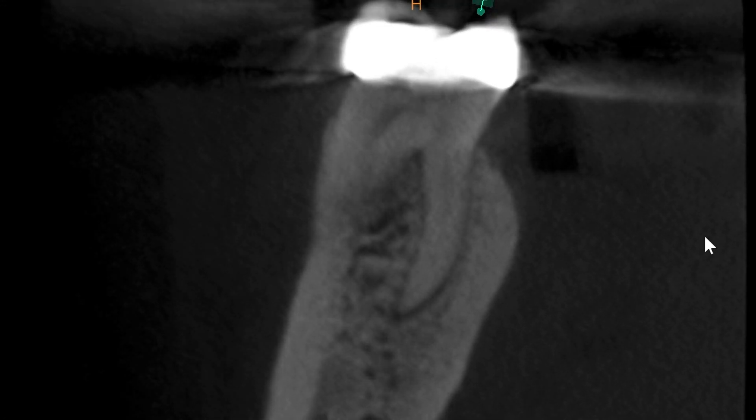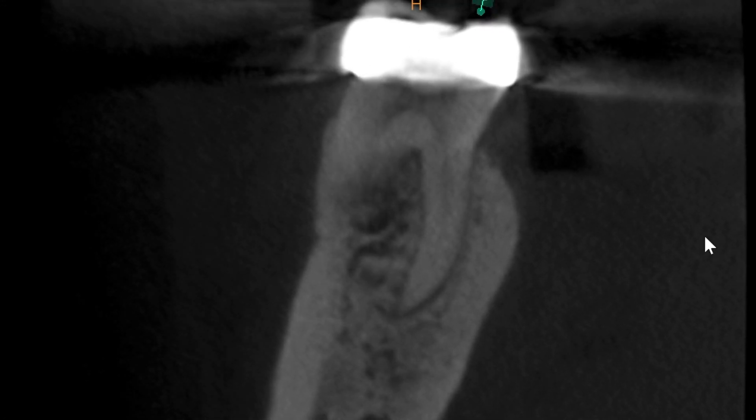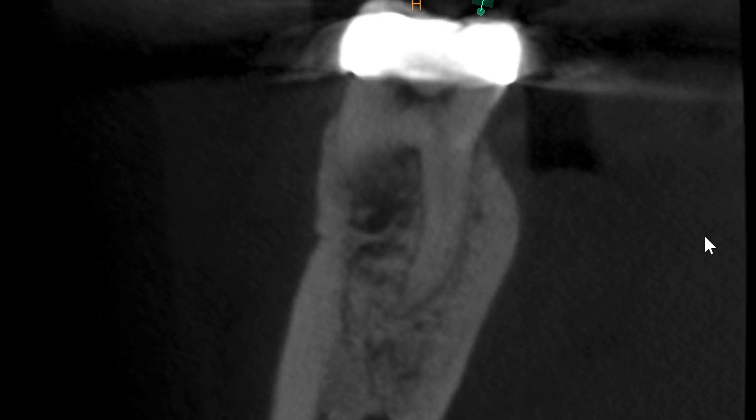The sagittal CBCT scan shows a widened PDL space, but the true appreciation for this Radix anatomy is visible in the axial plane. We can also see in the axial plane the large root system associated with that mesial root complex. When we switch to the coronal plane, it shows a clear view of that Radix root. There is a slight sweeping curve back to the buccal, but nothing terribly significant — though the significance can only really be appreciated on these scans.